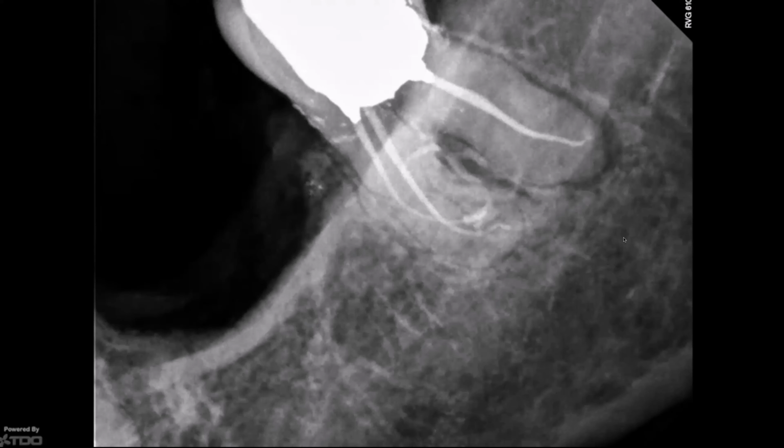And this is an example of a straight squirt technique. There's some cases where patency is extreme. We have a whole discussion related to cases where we don't have apical patency and we're using the device to allow for that to be possible. So in those cases, I'll just basically inject the canal with the BC, use the plugger so that I don't have a pool of sealer in that space, then use my Obtura with the smallest gauge to then backfill the case.